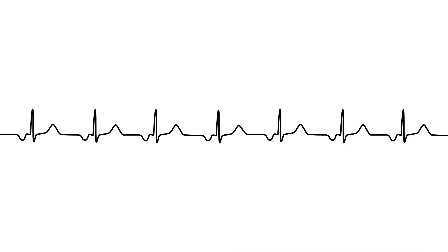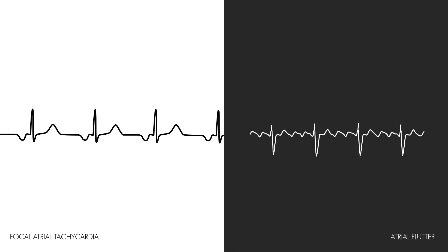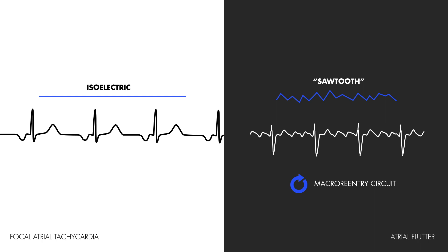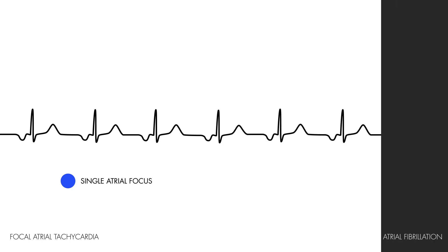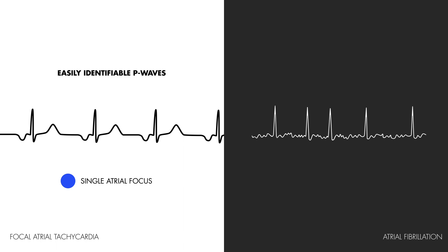This rhythm might seem similar at first to other atrial arrhythmias, but compared to atrial flutter, focal atrial tachycardia has an isoelectric baseline, as opposed to the sawtooth baseline seen in flutter. This stems from the fact that in atrial flutter, rhythms are the result of macro-reentry or larger circuits, whereas in focal atrial tachycardia there is a single atrial focus that classically conducts in a 1-to-1 ratio with the ventricles. Compared to atrial fibrillation, in focal atrial tachycardia P-waves can easily be differentiated, whereas in atrial fibrillation it is often difficult to make out clear P-waves because of the erratic depolarization of many ectopic atrial foci, which can occur almost simultaneously.